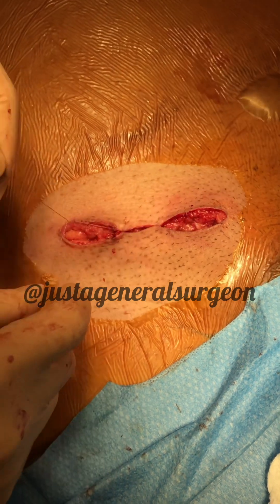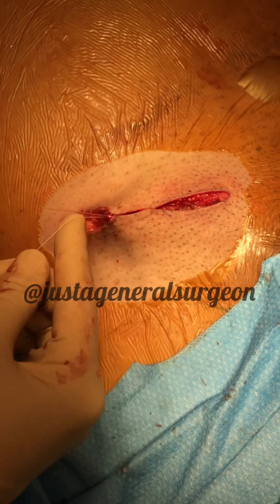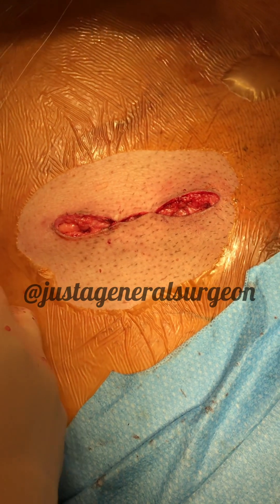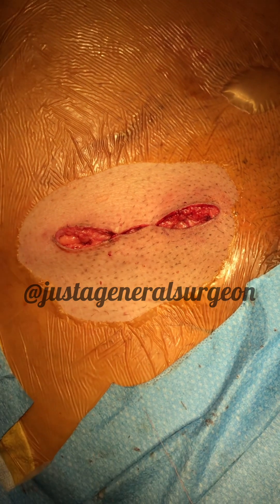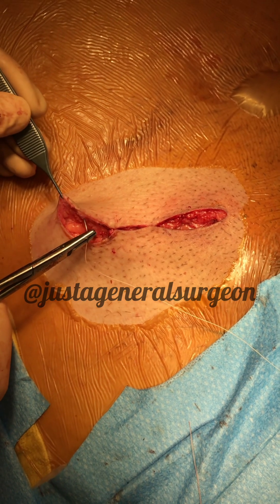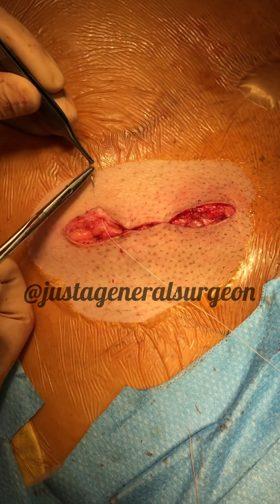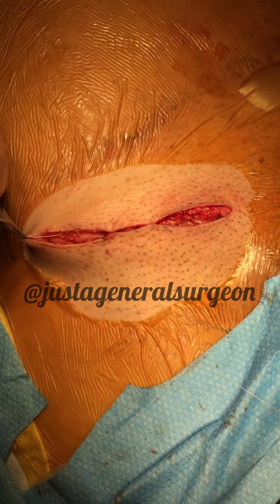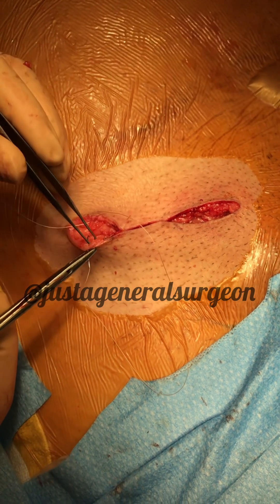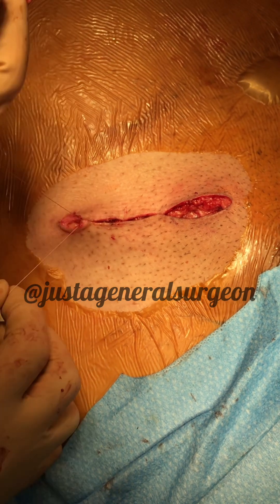So this is a one-handed tie. I'm giving myself tension so I can see the target. This is the two-handed tie.